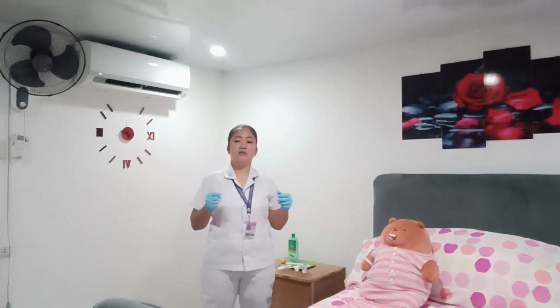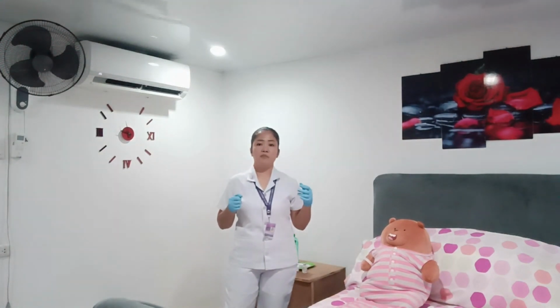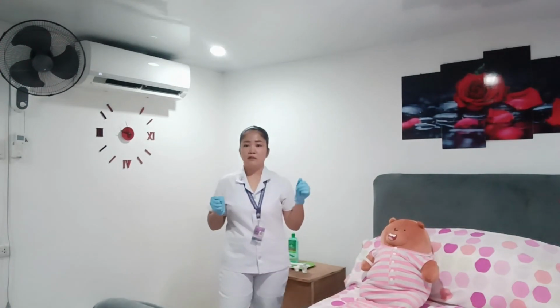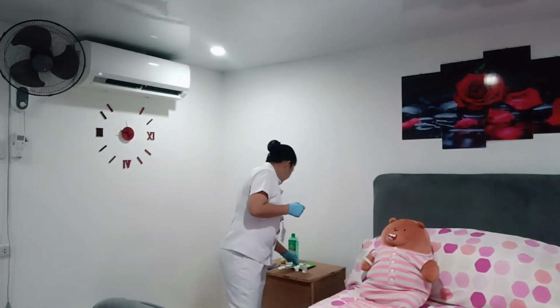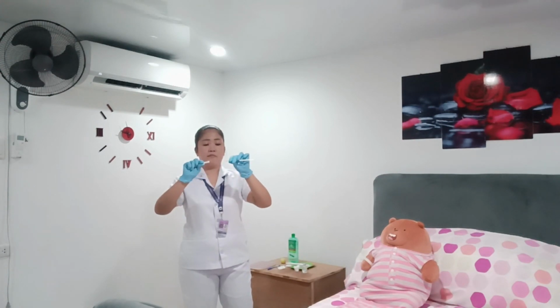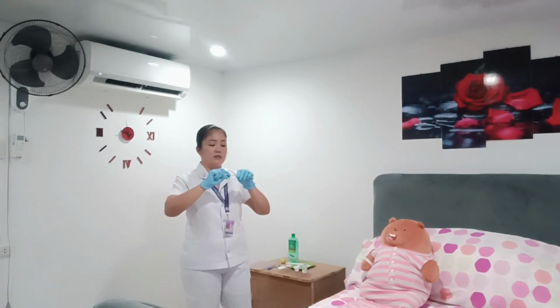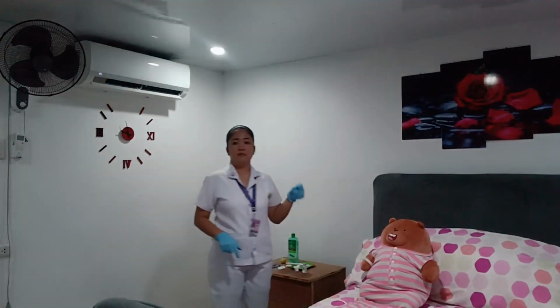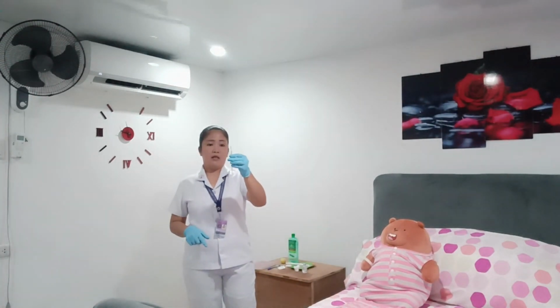While waiting for the antiseptic to dry, I will remove the cap of my syringe and expel any air bubbles from the syringe. When you're recapping it, you could do it like this, or like this. One hand. I could recap with one hand. And then I'm going to expel the air.